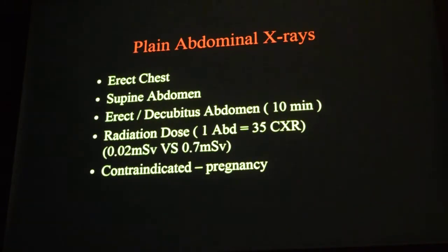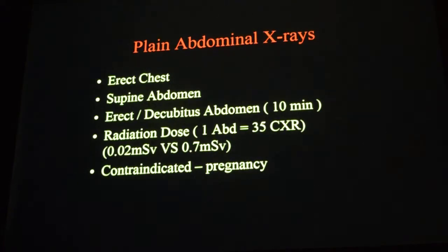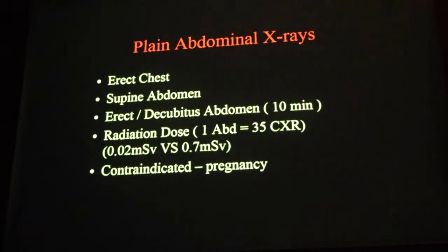So just imagine, you should not be asking, or the clinician should not be asking, for an abdominal CT unless it is really needed. You see the importance of radiation. You are giving 250 times the radiation dose that you are giving in an abdominal X-ray. It's already 35 times more than a chest X-ray. So just imagine. Doctor, again, I didn't understand. So abdominal X-ray is more radiation than chest X-ray, and CT is 250 times more than an abdominal X-ray.